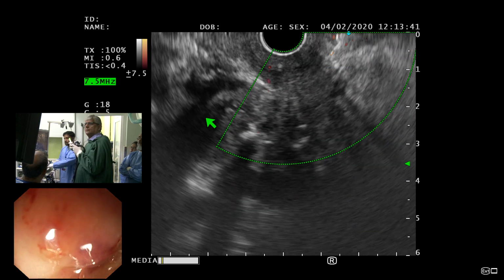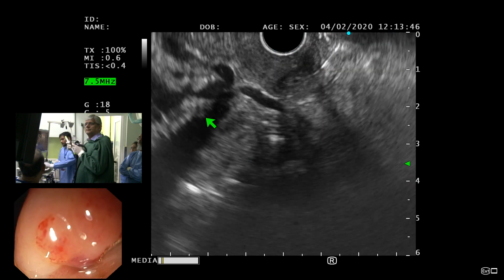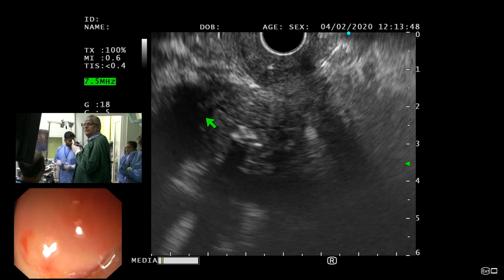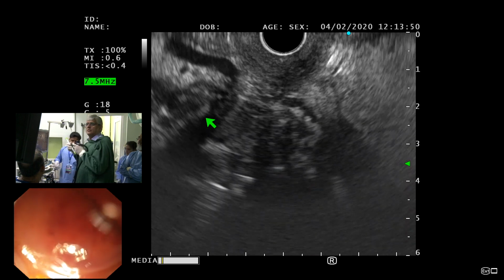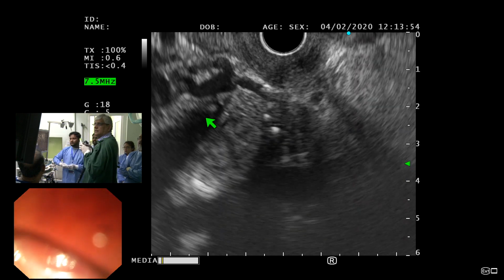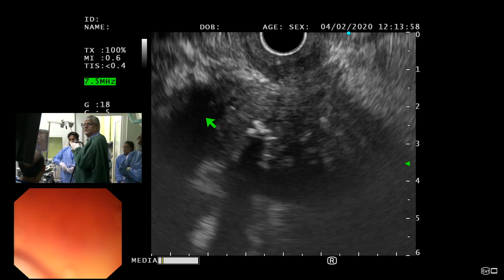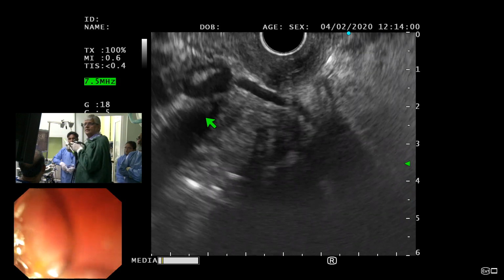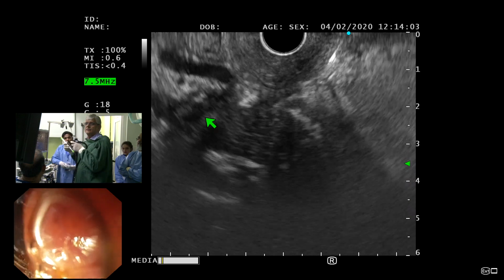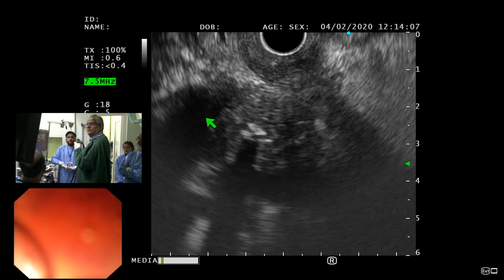No, just for now. Turn it off. Can't see the needle yet. So we are deep into the thing, but I am losing it.